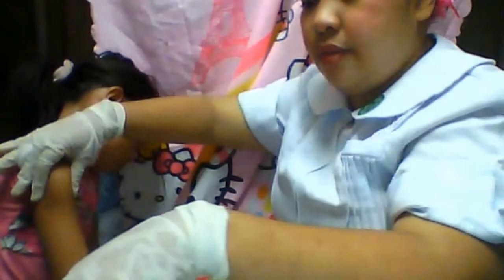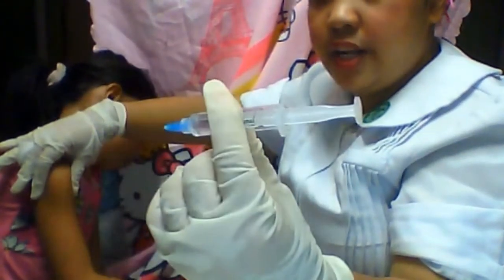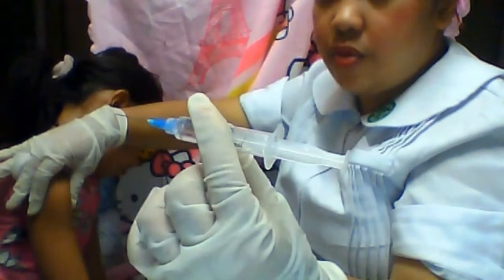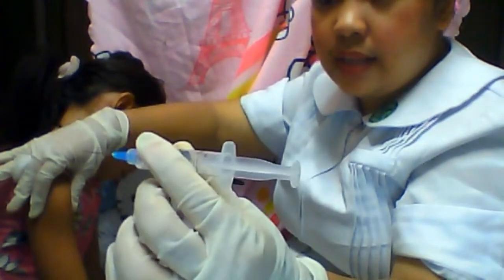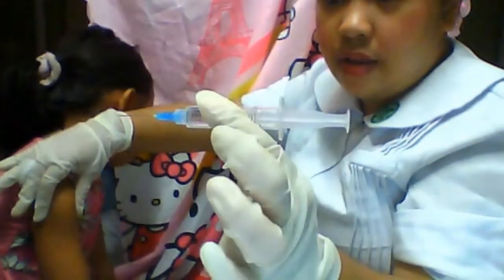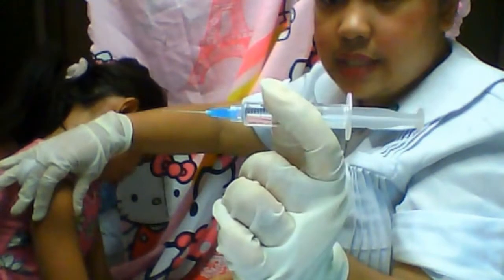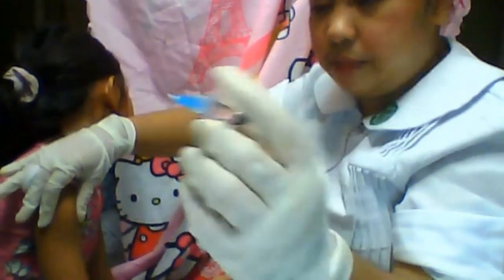Open, and then hold it like a dart. For this intramuscular injection, we do it at 90 degrees. At 90 degrees, we mean straight. We do it straight, and for this size of the needle, we inject it fully.